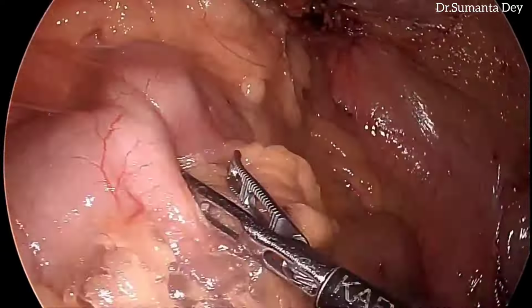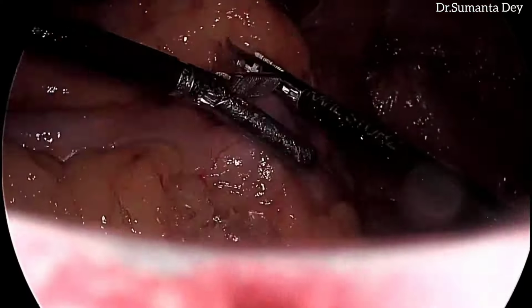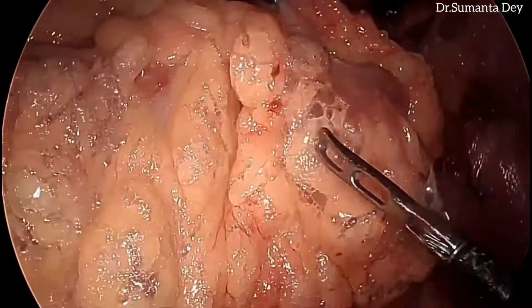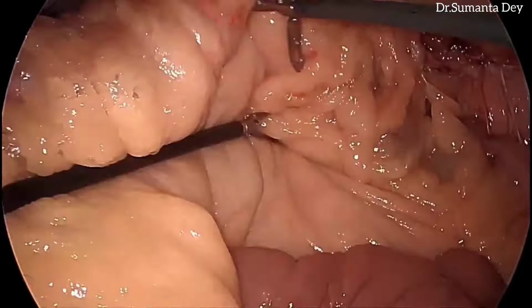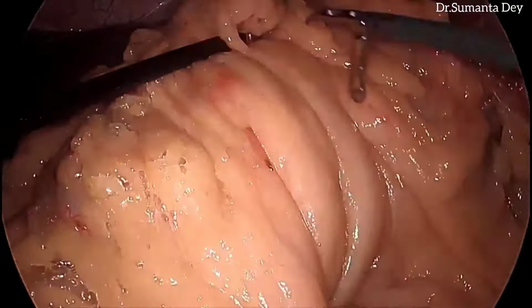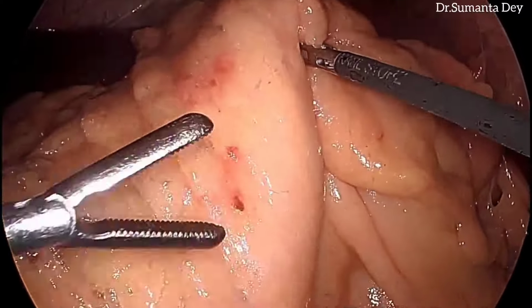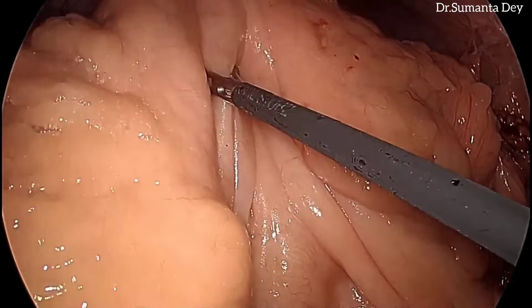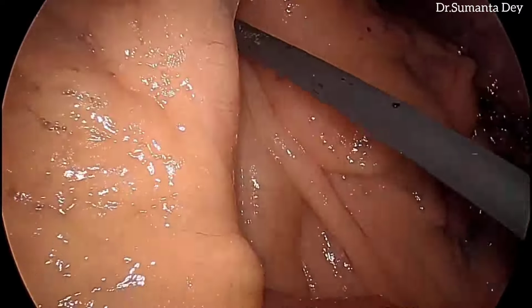So my plan is to go inside and first of all assess the growth. There is no serosal invasion, no obvious enlarged lymph node both radiologically and on examination. There is no local infiltration, no ascites, no evidence of metastasis. The lesion was very close to the splenic flexure, in the distal transverse colon.